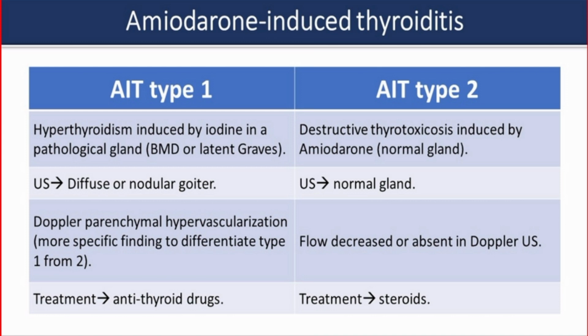But in amiodarone-induced thyroiditis type 2, there is a destructive thyrotoxicosis induced by amiodarone in the normal gland. Ultrasound finding, normal gland. Doppler flow decreased or absent in Doppler ultrasound. The treatment of type 2 is steroids.